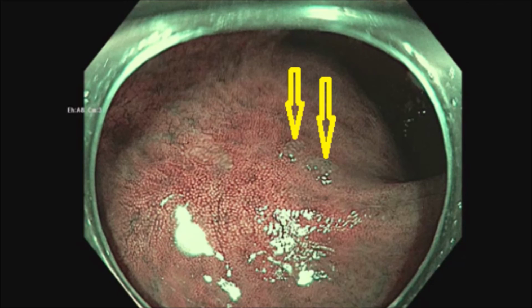Use these skills of pit pattern analysis to distinguish the pits of either SSL or adenoma, both of which are neoplastic and need resection, from the changes sometimes seen in the base of the scar and the changes of clip artifact.